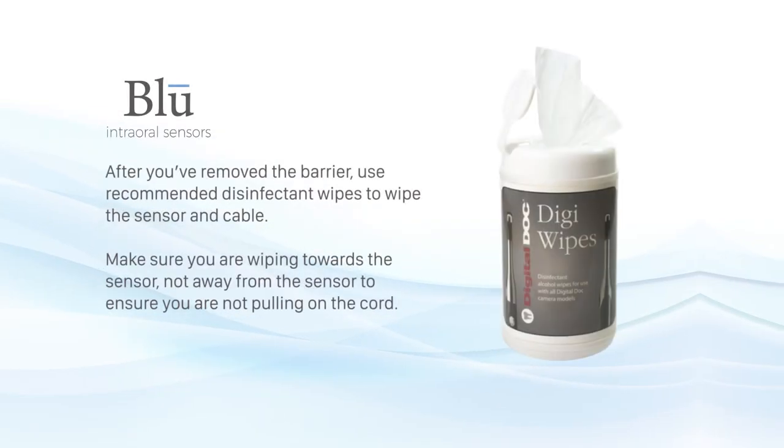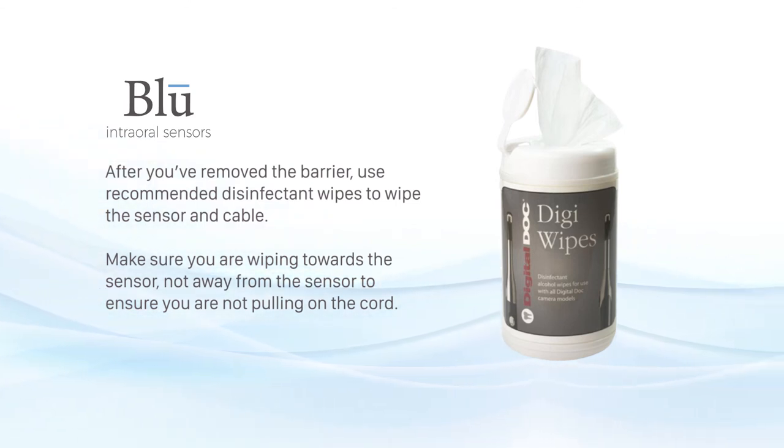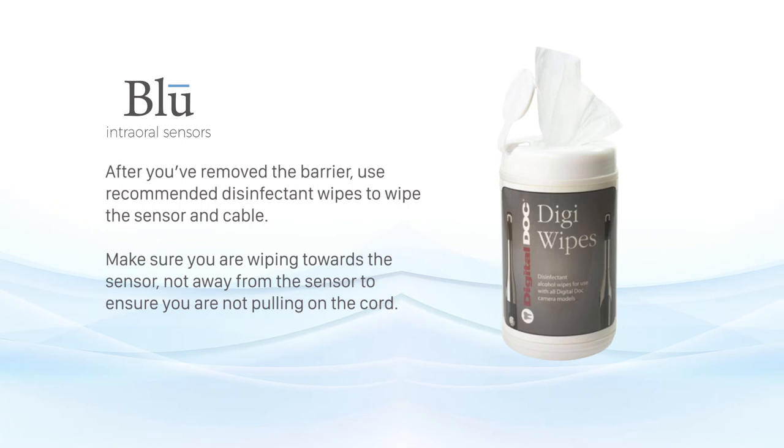Proper disinfection of sensor. After you've removed the barrier, use recommended disinfectant wipes to wipe the sensor and cable. Make sure you're wiping towards the sensor, not away from the sensor, to ensure you're not pulling on the cord.